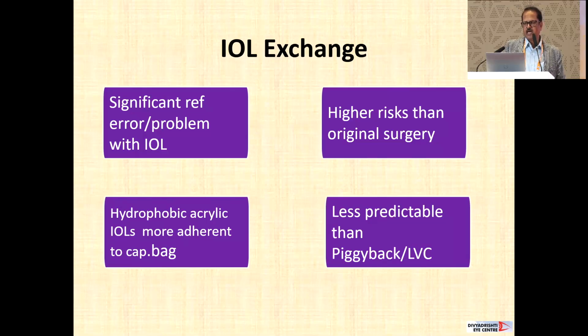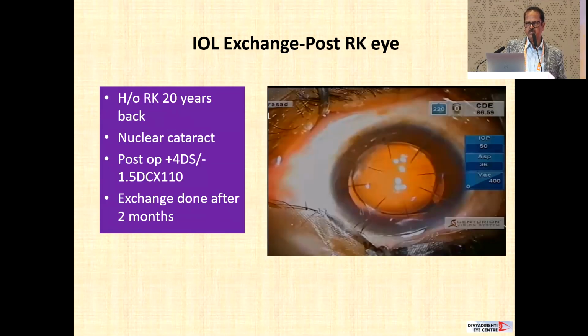So in IOL exchange, if the problem is significant or the problem is with the IOL, these patients can be subjected to IOL exchange, but again, it is less predictable than the piggyback and the laser vision corrections. And the chances are there of strong adhesions in patients who are coming late.